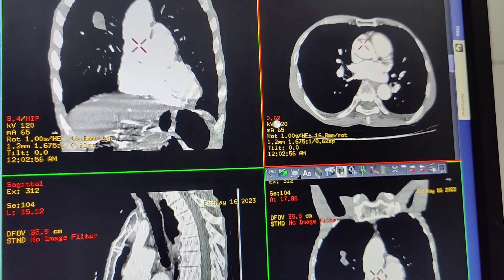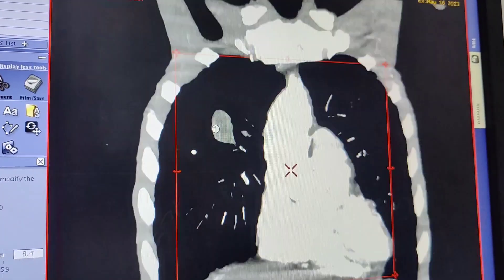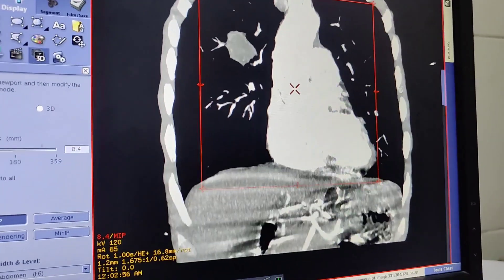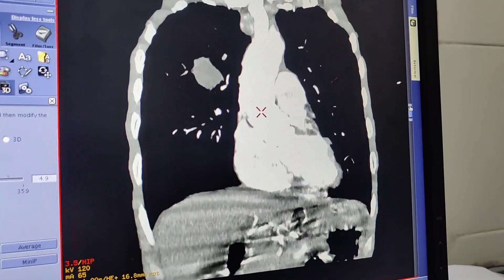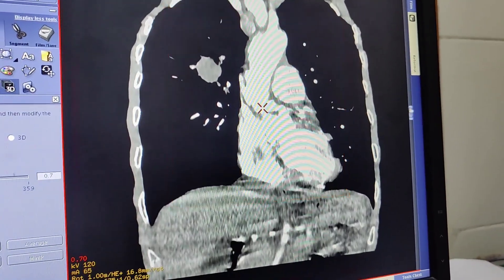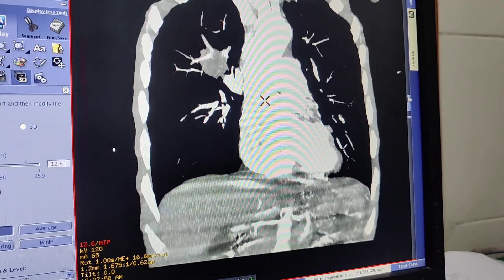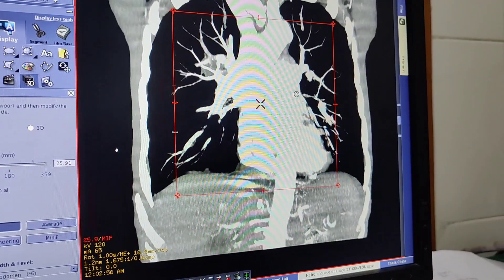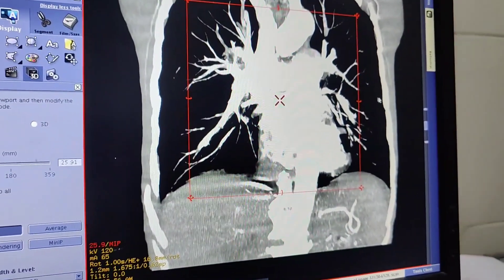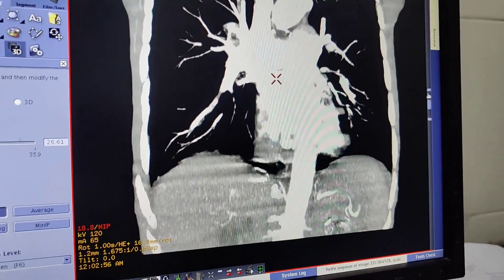If you scroll through, that's just how it looks normally with this projection. We're going to change the view right now. Here we have a MIP — maximum intensity projection. This view is great for looking at vessels, at the pulmonary arteries. You see how the vessels and the branches kind of illuminate, and you can see them very nice and clear. That's maximum intensity projection.